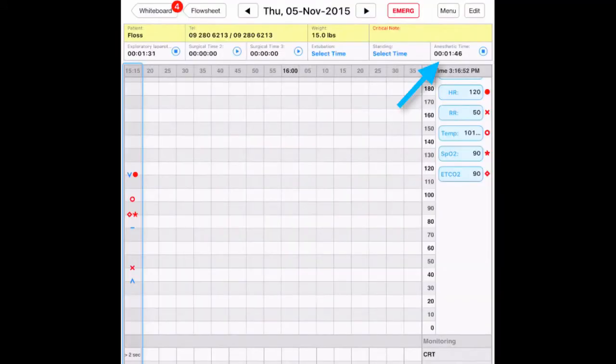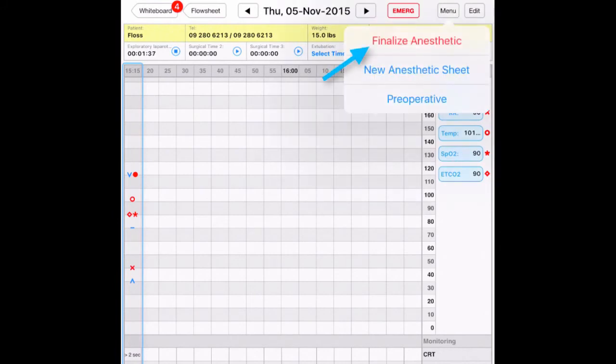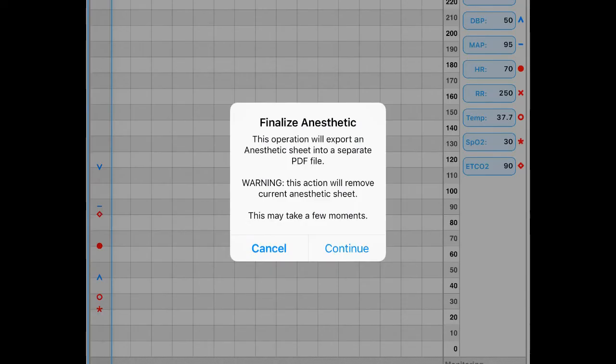To end anesthesia, press stop on the anesthetic timer. Next, click menu and choose finalize anesthetic.